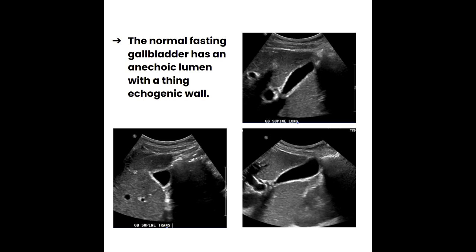Section 4.9, normal ultrasound appearance of the biliary tree. In a fasting or NPO patient, the normal gallbladder appears anechoic with a thin echogenic wall. Here we have the gallbladder — nice and anechoic, no sludge, no stones — surrounded by a very thin echogenic wall. Notice how the fundus hangs just outside the inferior margin of the liver, with the body and then the neck more superior, near the portal vein.